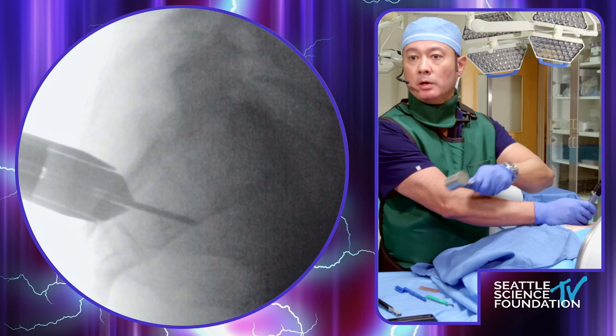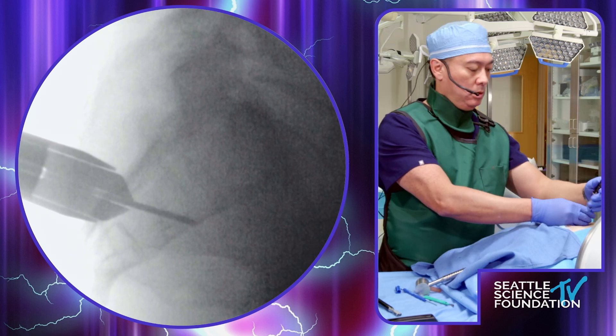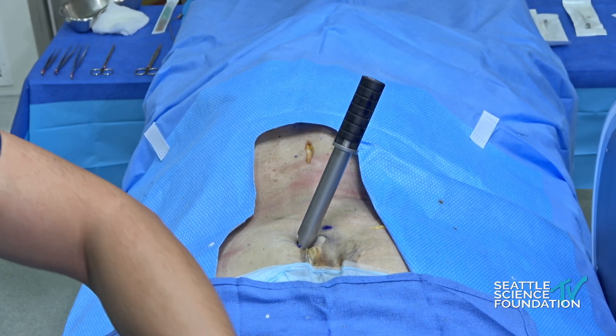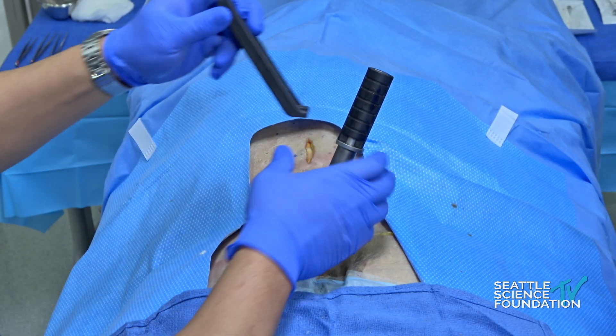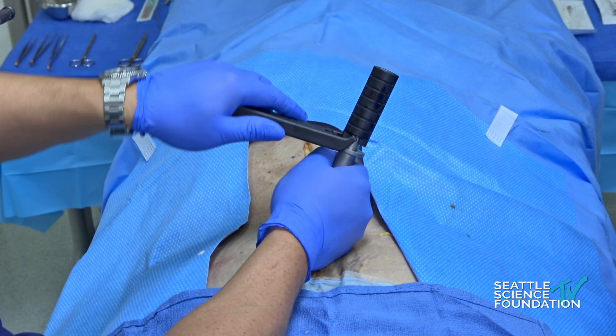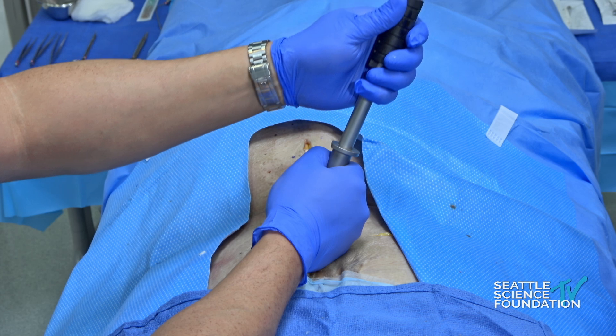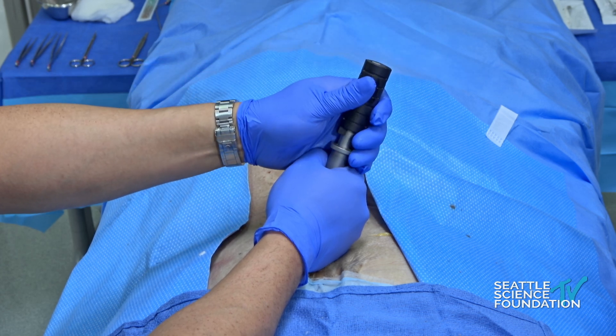Let me back up that K-wire a little bit — pop that out a little bit. To be on the safe side, you'd want to make sure that K-wire is not just popping through there.